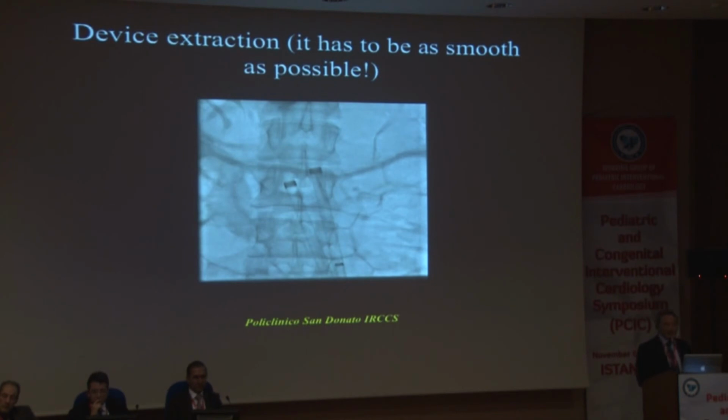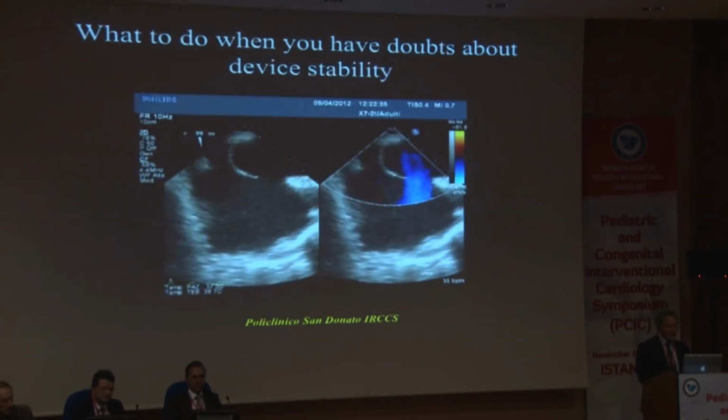Well, it would be better to avoid embolization, of course. But if it occurs, again, don't panic, just think about that, because most of the times there is no hemodynamic compromise of an embolized device. So you have time to think about what to do.